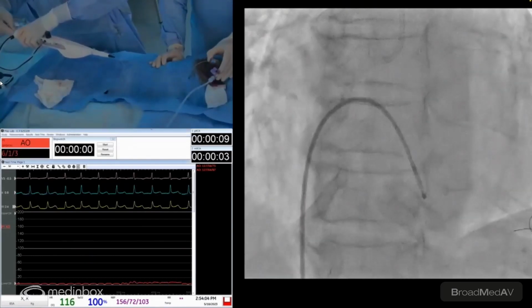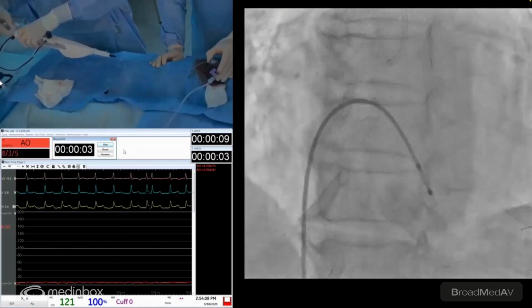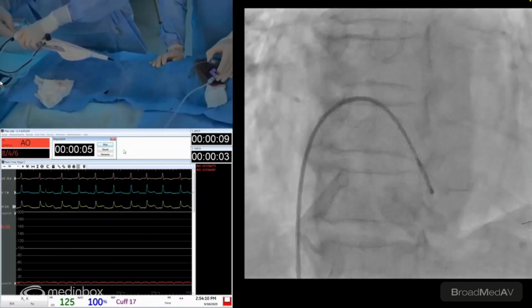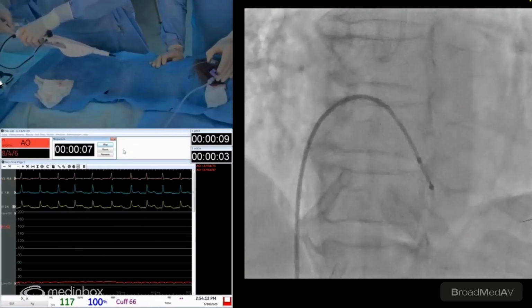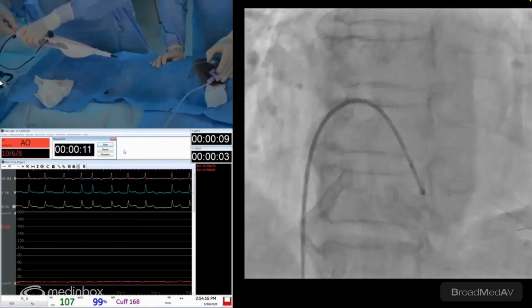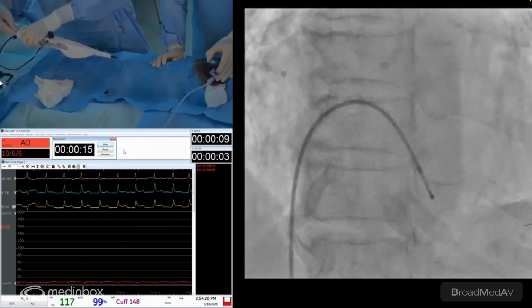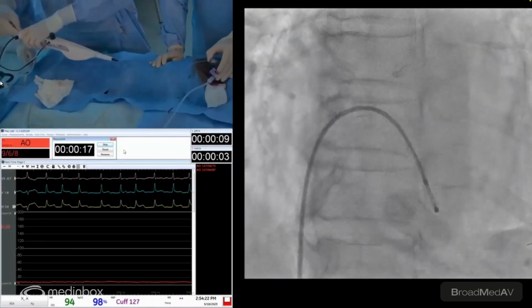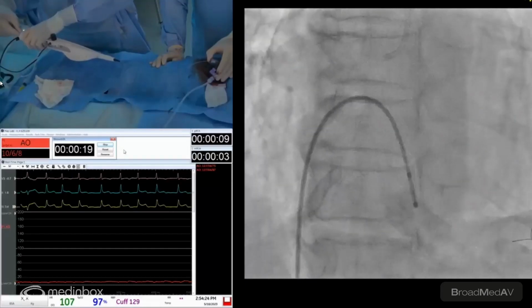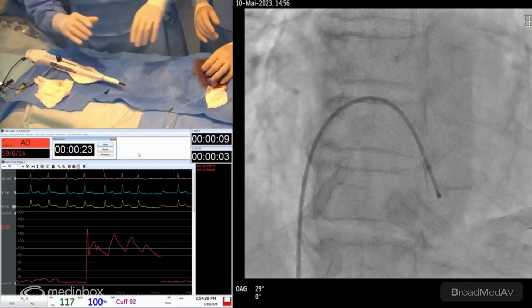Let's prepare the microcatheter. Open the turnpike. We have some ST elevations I can see. This could be potentially some no reflow. So we'll take out the burr and we'll give some verapamil. We'll check the pressure. And we'll swap our rota wire for a workhorse. Okay, there we go. All right.